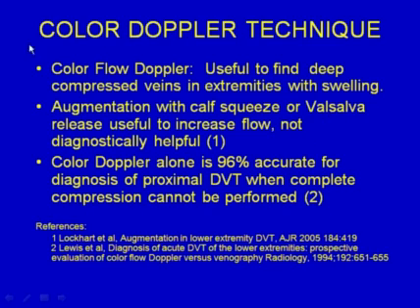Well, first of all, the color Doppler technique I think is useful to find some deep compressed veins in patients who have a lot of edema or swelling. You can help by squeezing the calf or using a Valsalva release to increase the flow, and that will help you see the vessels with color. This is not helpful diagnostically in terms of augmentation.